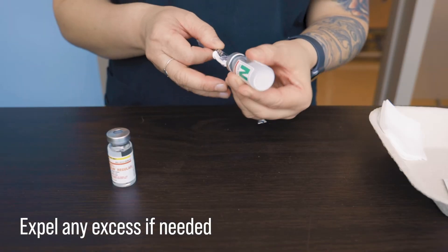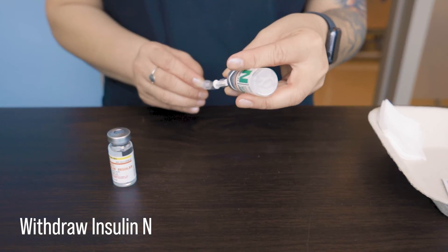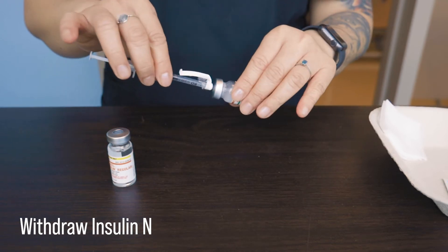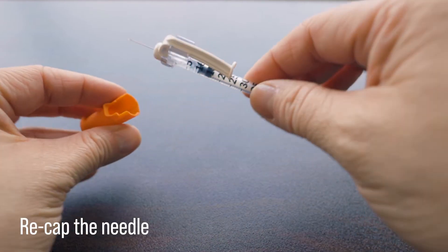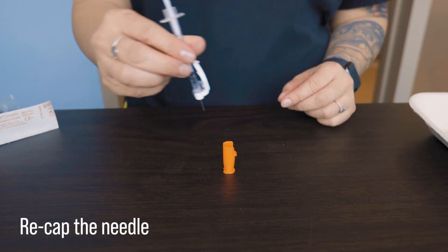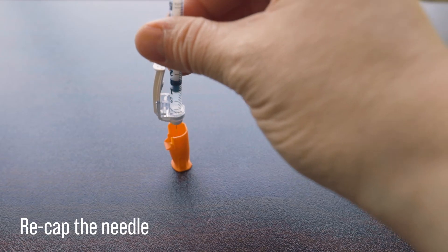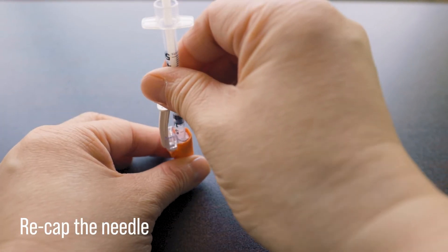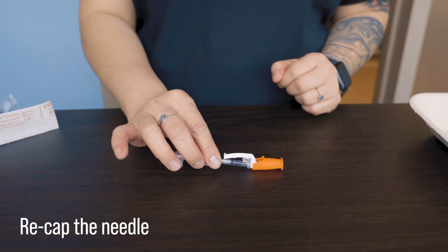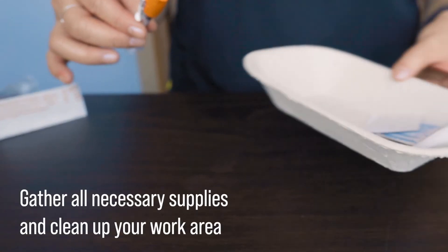We then go back to the insulin N vial, and because we've already prepared it earlier with the air, all we have to do now is withdraw the amount we need, which was 15 units. Once we have the amount we require, we can replace the cap on the needle. This is the only time that we're allowed to recap a needle, because the needle is still clean. We never recap a used needle for safety reasons. There are multiple ways to do this, each with its pros and cons, but here are a few examples.